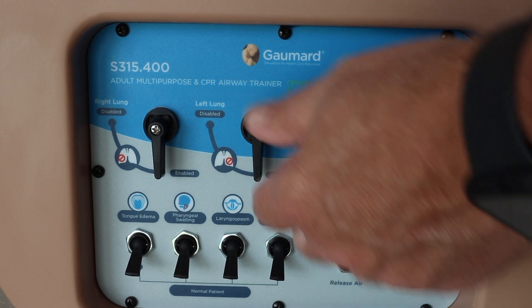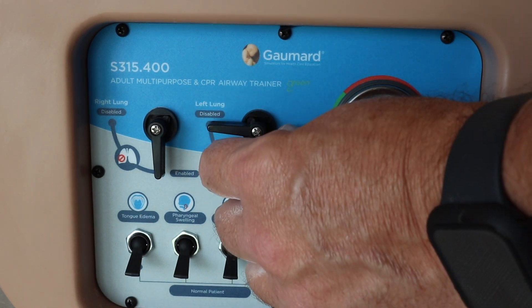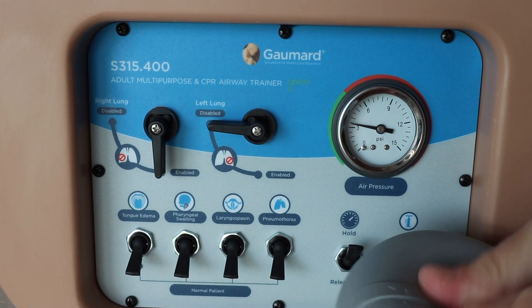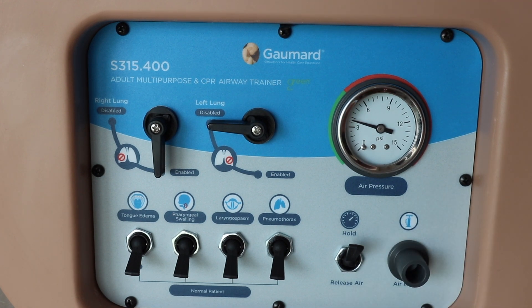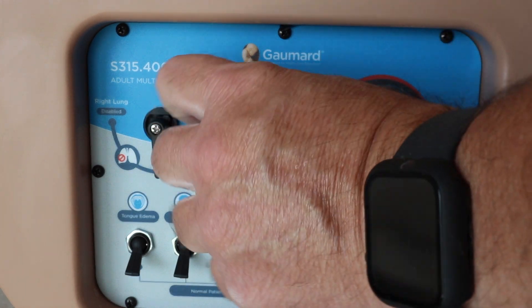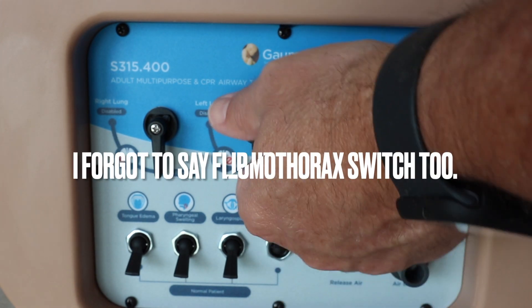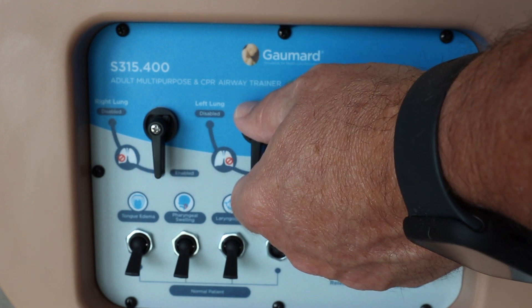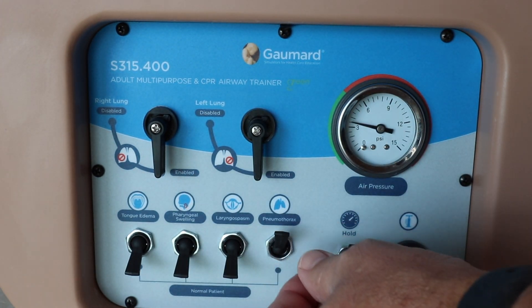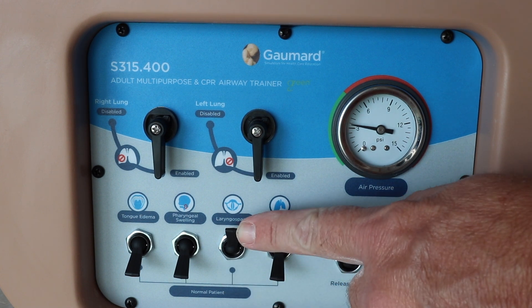Flip your switch up for hold and pressurize your system. Once it's pressurized, if you flip the knob up for lungs disabled, that's going to mimic a dropped lung. So if you're running a scenario where you've got a student who needs to decompress, you're going to flip the switch up for disable and that will mimic that scenario. It's important that you only use the second intercostal space on this mannequin whenever you're managing a tension pneumothorax.